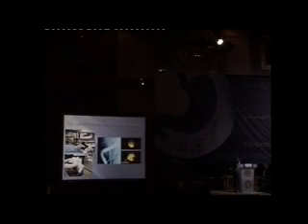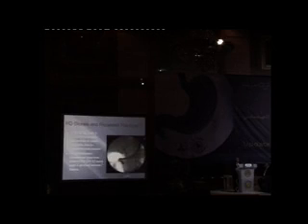All these modalities are proven to be very safe and very effective, with success rates ranging from 75% up to almost 100%, and very minimal complications of less than 6%. This is the SpyGlass here, and this is how you see the stones that can be fragmented with the electrohydraulic lithotripsy. Now, this is another case. Here is a 47-year-old man with a 5-year history of recurrent acute pancreatitis.